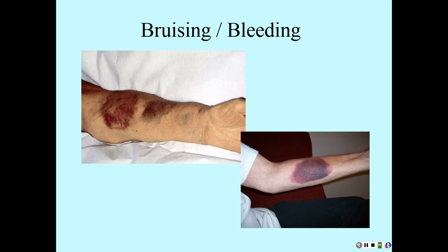Just a lesson I learned, especially with the elderly with the fragile veins that just pop at nothing. So if you miss an IV on somebody, go to the other side. If you miss that one, then you can go back. Hopefully this one has clotted off enough that you're not going to have a goose egg, but it does happen. Will you do this to a patient? Yes, you will. You won't like it, but it does happen.